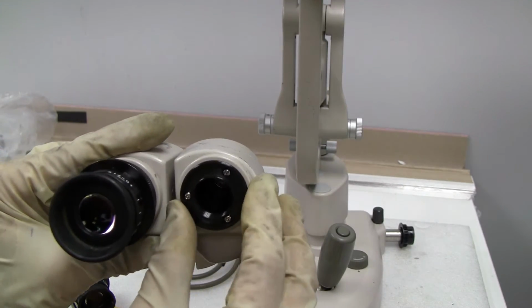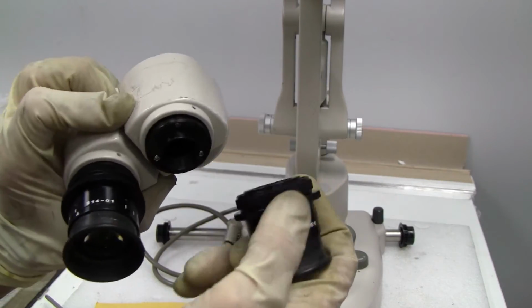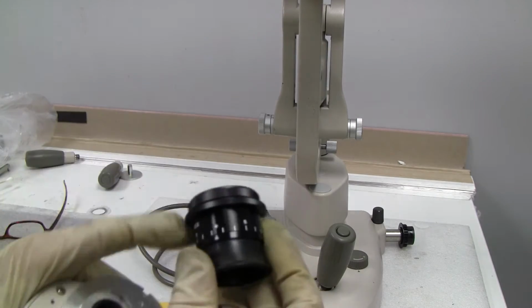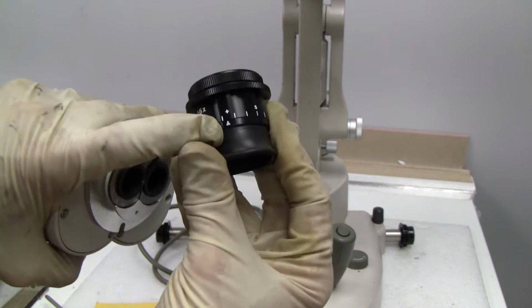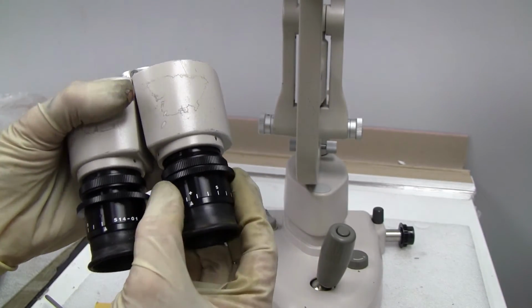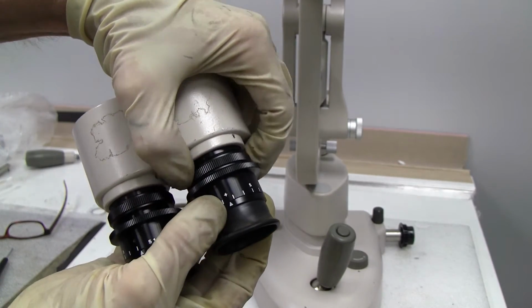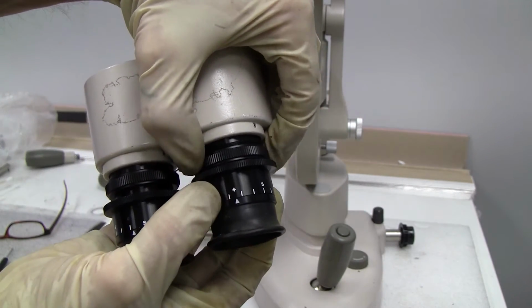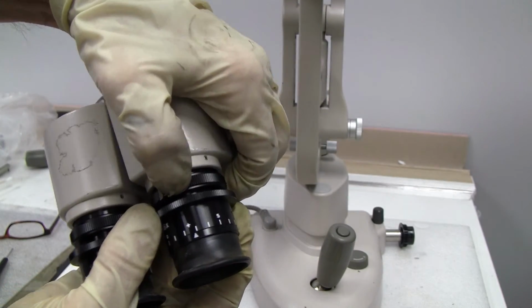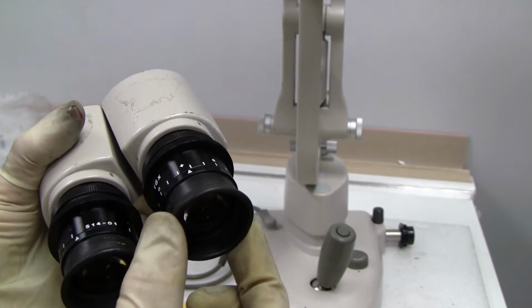Once you have that loose, screw your eyepiece back on. Find your arrow, put that in the center. And then tighten it up while you're holding your arrow. Once you have that tight, see, now you can move your eyepiece.